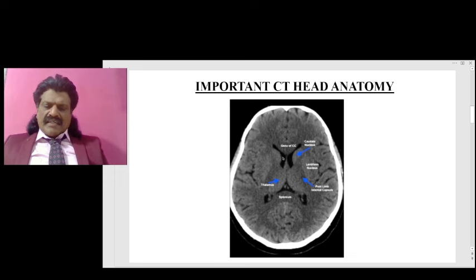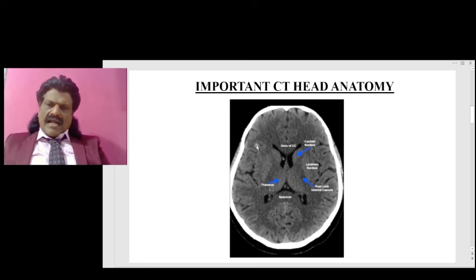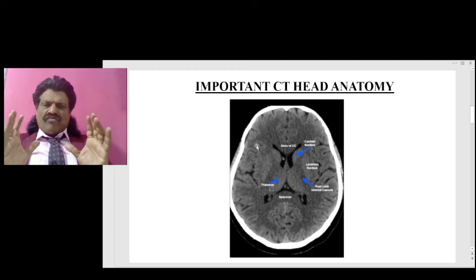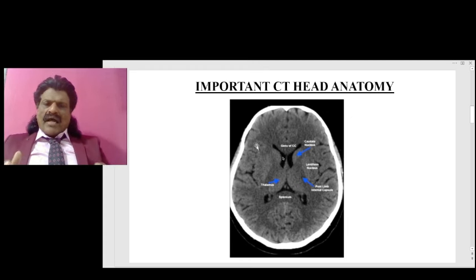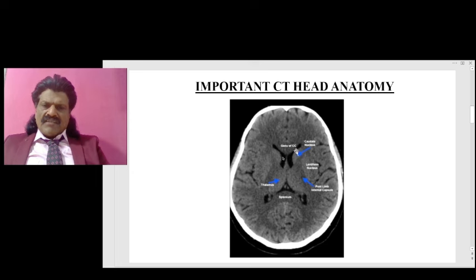These are the important landmarks of CT head anatomy, and therefore one has to get familiarized with this CT scan anatomy. This is probably the most important slice of the CT head, wherein there are important landmarks — especially the internal capsule — because the internal capsule is one region where infarct is very common. As I said in the earlier edition, CSF appears dark, so these are the frontal horns of the lateral ventricle.